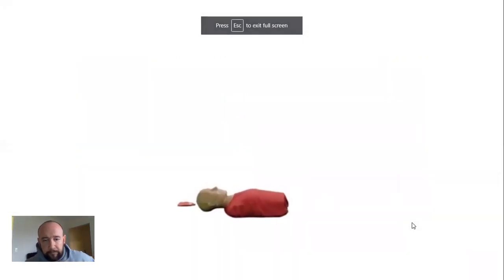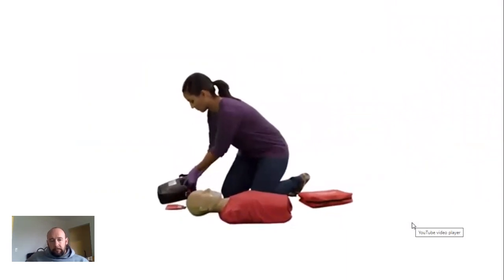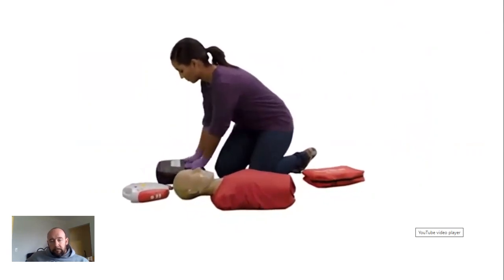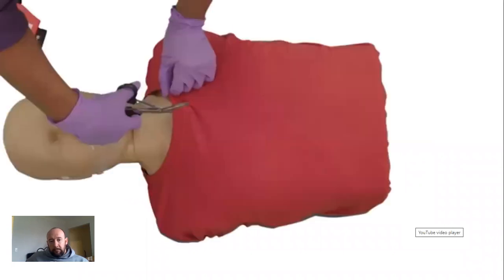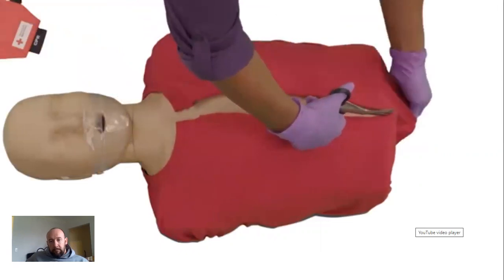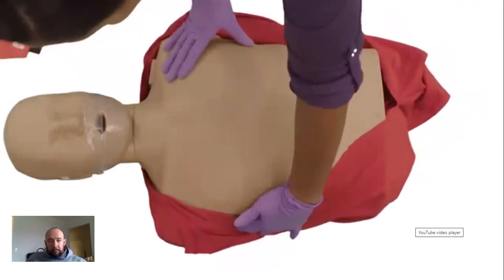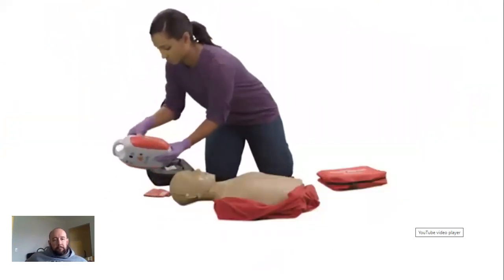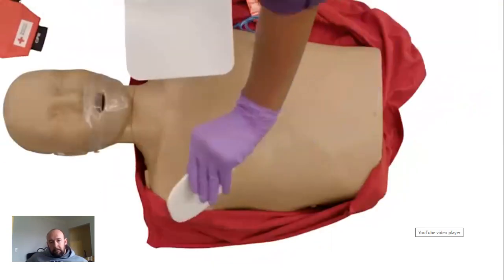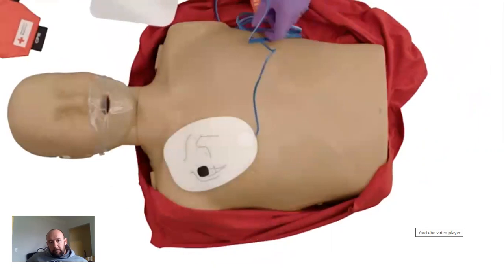When a person is in cardiac arrest, use of an AED can help restore a normal heartbeat. If you are the only trained responder on the scene, turn on the AED as soon as it is available and follow the voice prompts. Once the AED is turned on, remove all clothing covering the chest and wipe the chest dry if necessary. Attach pads firmly to the person's chest as shown. Using the appropriate sized pads, place one pad on the upper right side of the chest and the other on the lower left side of the chest below the armpit.